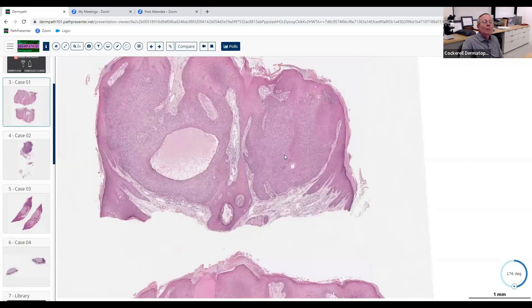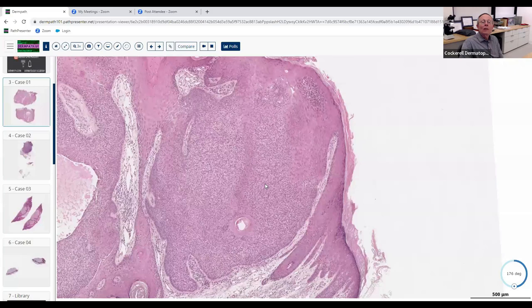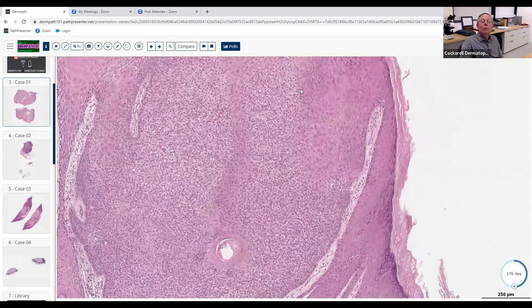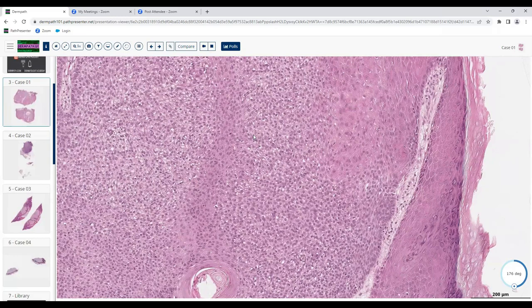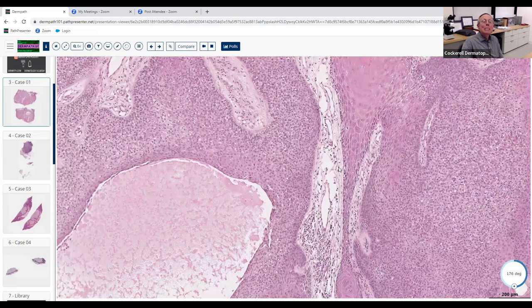Let's go to higher magnification in this area over here. So what kind of differentiation do you think we're looking at right here? I would call this poroid differentiation. That's one possibility. They also look a little bit like clear cells.